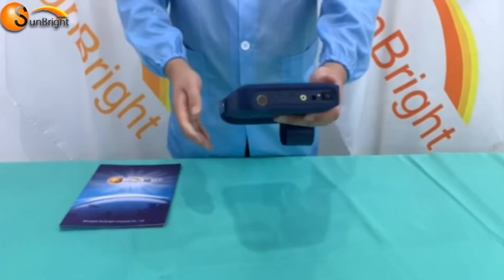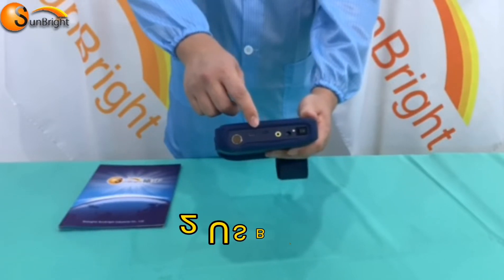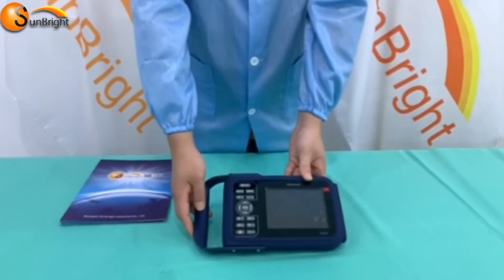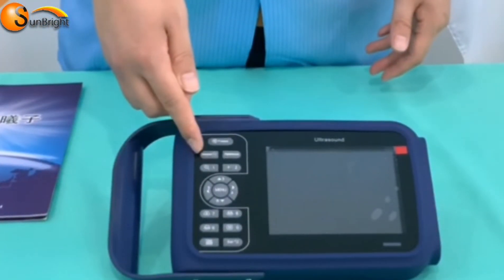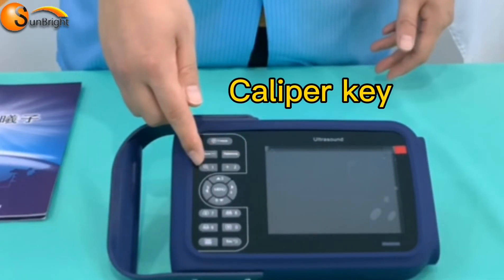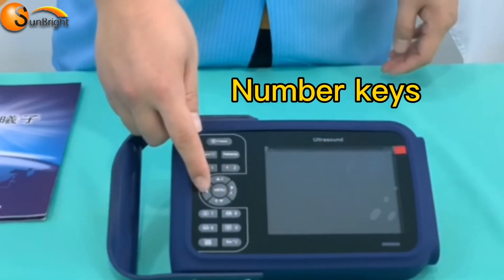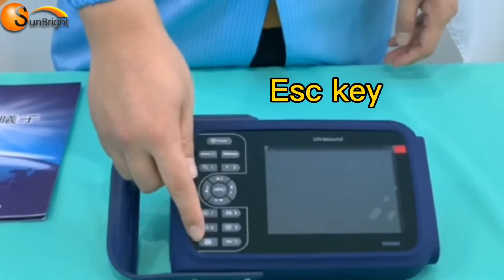The machine has a charging port, HDMI port, and two USB ports, with the probe connector at the right side. At the front of the machine, you can see the Freeze key, Measure key, Reference, Magnification key, Caliper key, Menu key, Direction keys, Number keys, Mode keys, Clear, and Exit.